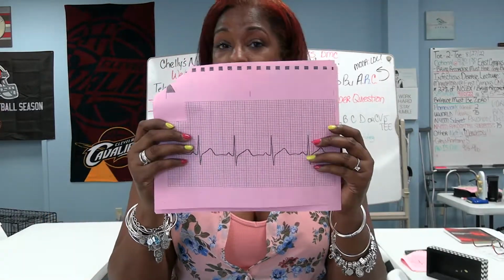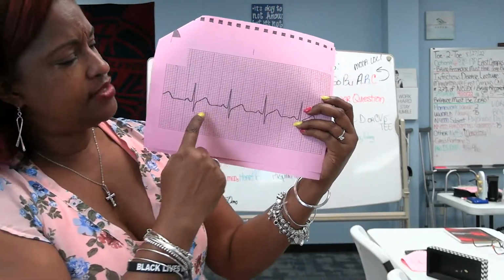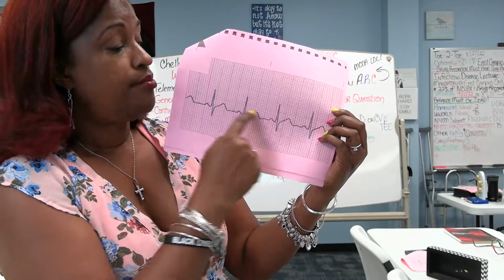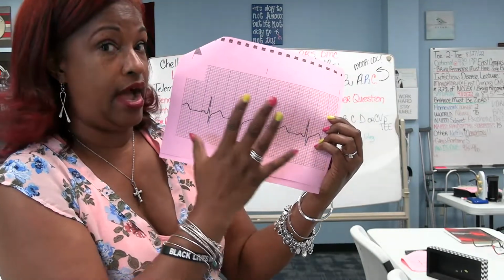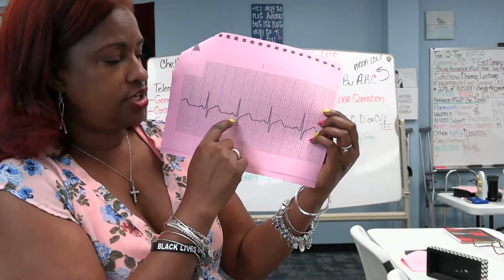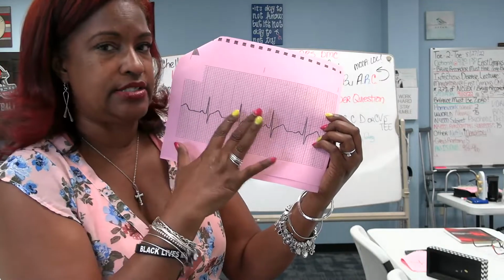Let's flip back to that one. You may not have this handout, but stay focused with me, please. Remember how I said this was extremely exaggerated, and we're going to be using this later, but it's extremely magnified and exaggerated. So much so that actually this would not be necessarily normal, but it is today.